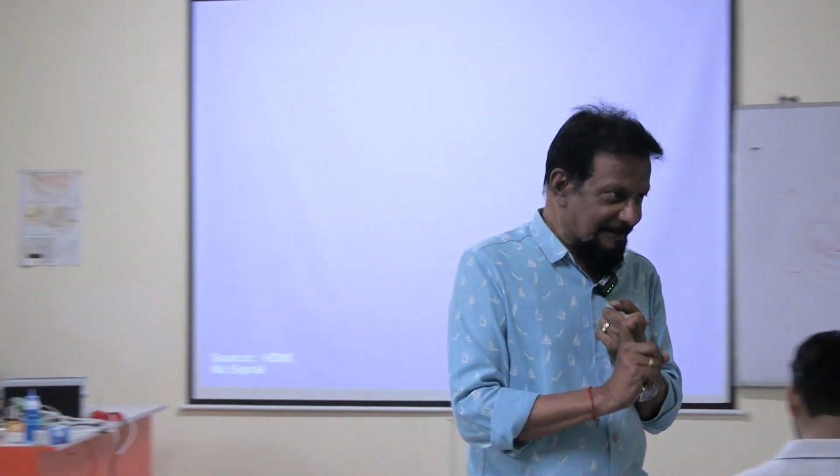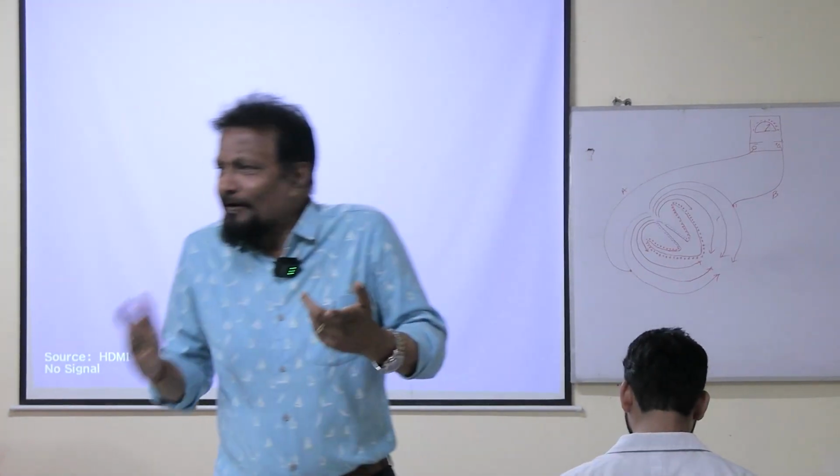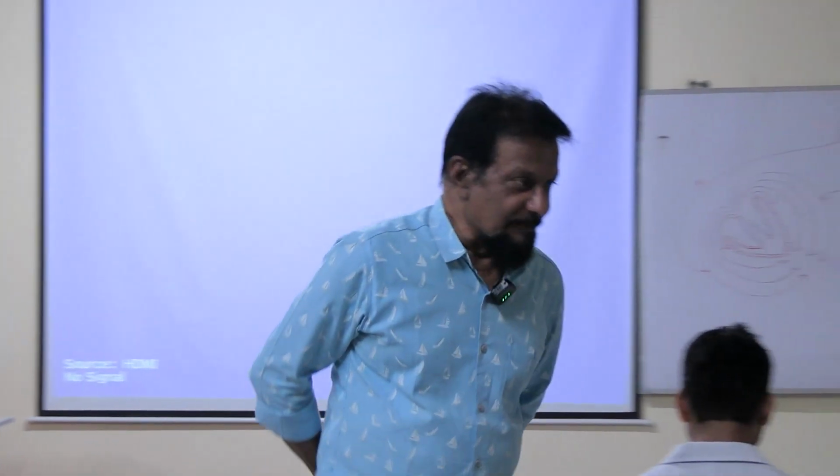So it's simple. Once you identify the V4 position and V2 position, it is very simple to find the V3 position, just in between V2 and V4. Draw a hypothetical line, not a line with a pen or something else. At the center of this hypothetical line is V3. So I got V1, V2, V3 and V4.